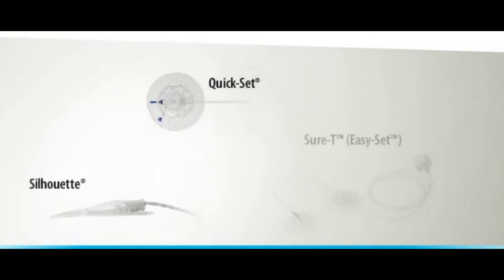There are three main infusion sets to choose from: Quick Set, Silhouette, and Sure-T. Let's take a look at all three.